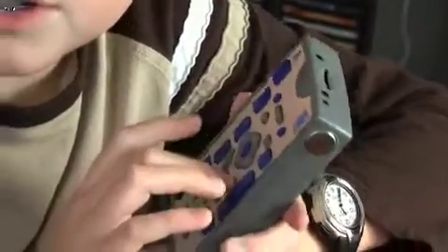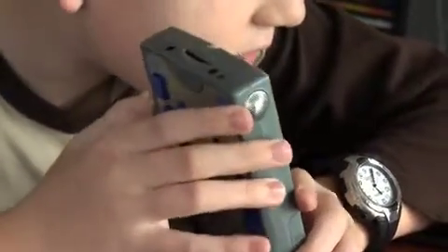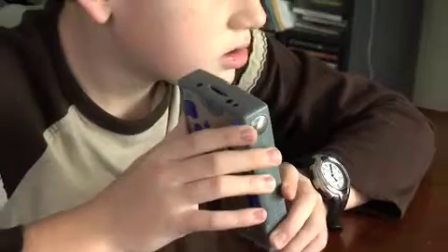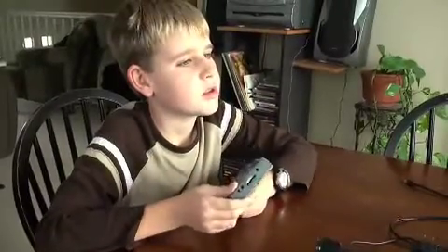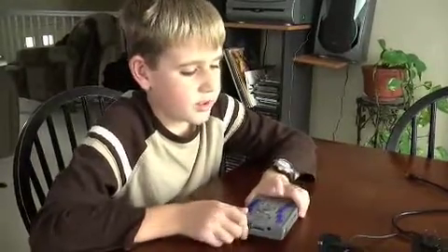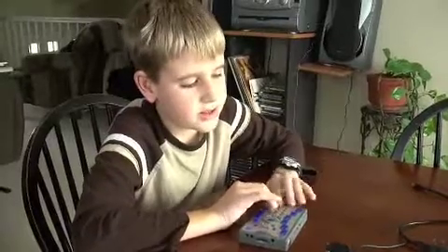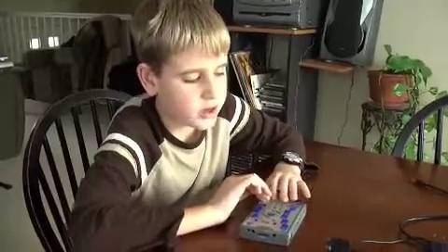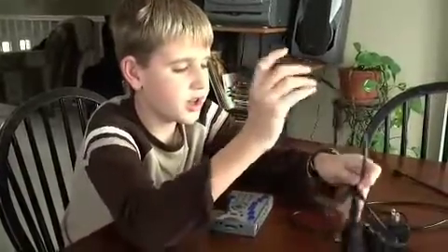If you put your ear close enough to your device, you're going to hear it kind of making a humming sound while it gets ready to start. Welcome to the BraillePlus software version 1.06, build 21. Applications menu. You heard it say, welcome to the BraillePlus software version 1.06, build 21, then a short pause, and then applications menu. If you didn't hear that, you'll want to plug your device in.